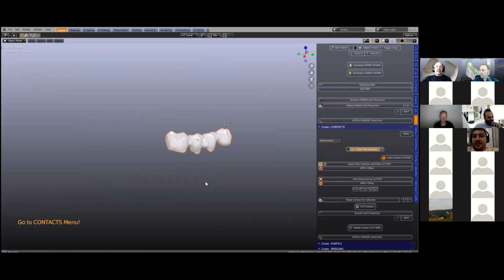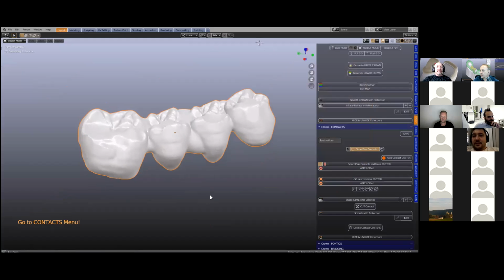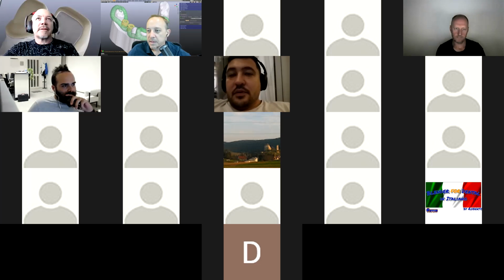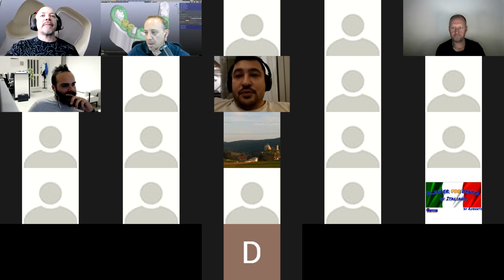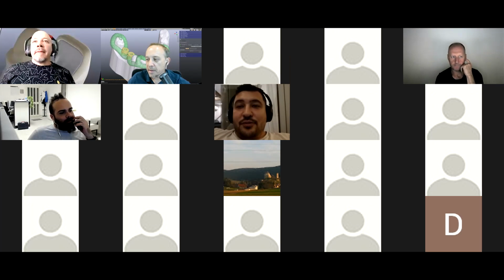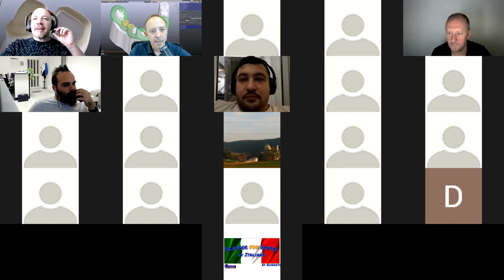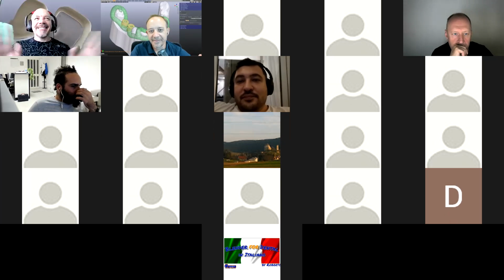Excellent. All right. So I stop sharing my screen. Was there a question about exporting, I think, to match the milling? I'm not so sure. I see Daniel is here as well. Hey, we've got a lot of history.